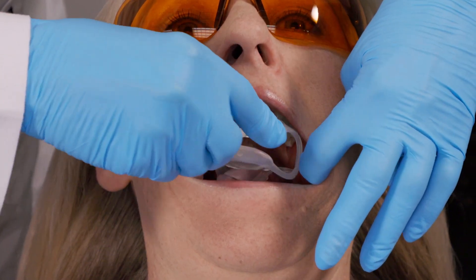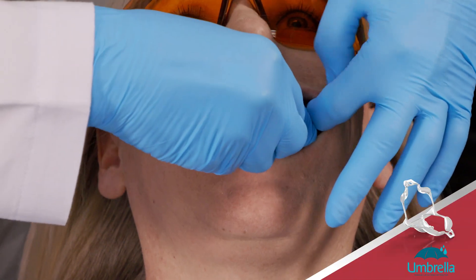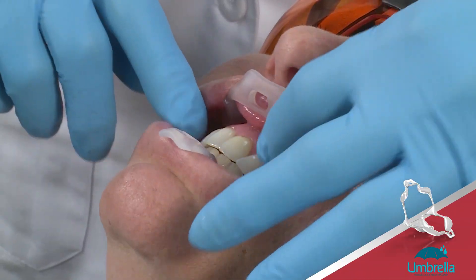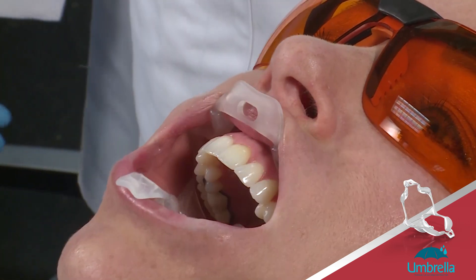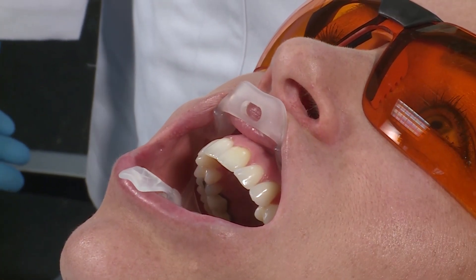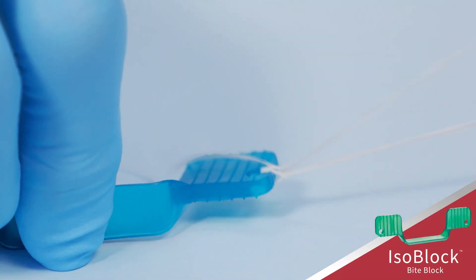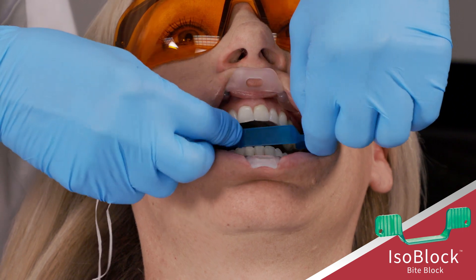Place a self-supporting lip and cheek retractor. We recommend the Ultradense Umbrella Retractor. Using the Umbrella Retractor helps the patient stay open in a natural and comfortable position. The isoblock can be used in conjunction with the umbrella if the patient is not able to rest passively with the umbrella in place.